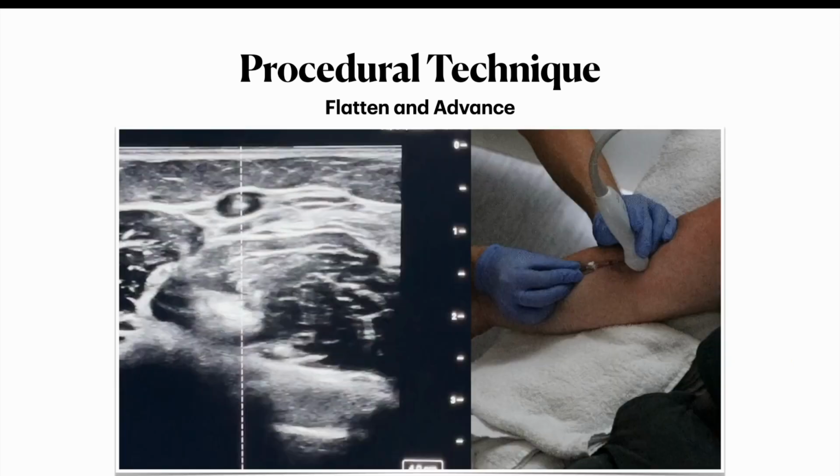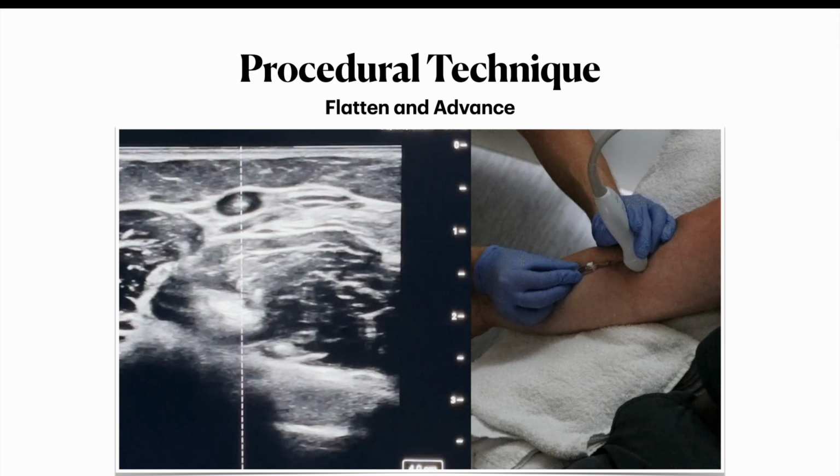So to put this all together, let's go ahead and watch this example where we will slowly advance the probe until the needle disappears with our left hand. Then we will move our right hand until the needle comes into view, move our left hand until it goes away, and so on.